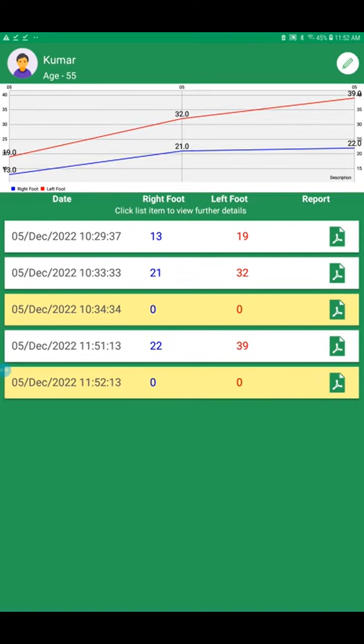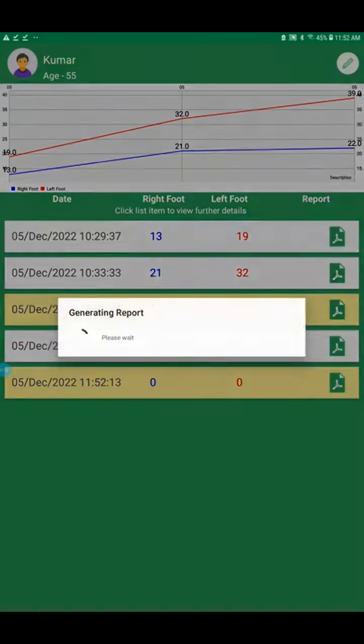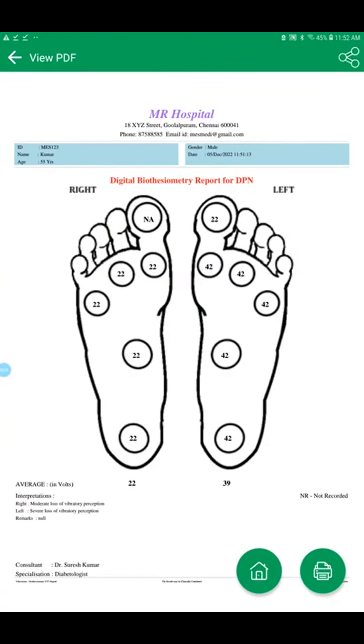Okay, I forgot to inform you about the VPT one. So let's see on the VPT. On the right toe we set 0 value. 0 means not recorded, so it says NA. That means we did not test on the toe. The rest you have the value. On the screen you see different colors for the interpretation, but on the printout it will be only in white color. Only on the screen you will get multiple colors.